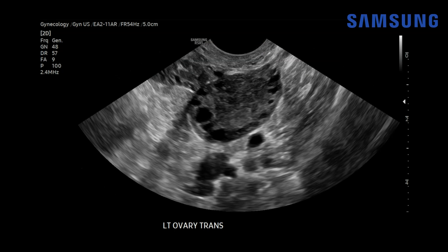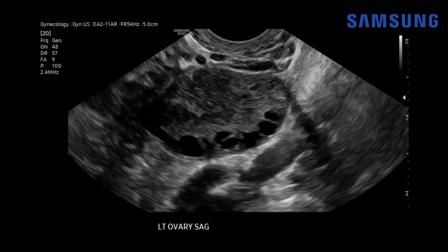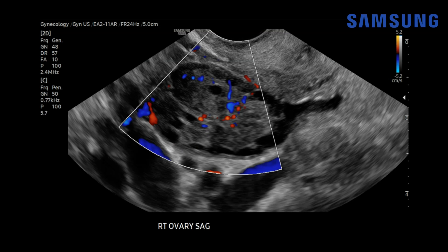When we turn our attention to the contralateral left ovary, we see similar morphology — these multiple small peripheral follicles with this prominent central stroma, and you can see that these peripheral follicles have a string of pearls configuration. When we add color Doppler back to that right ovary, we see normal color Doppler flow within the ovary. We don't see any disorganized or increased flow.